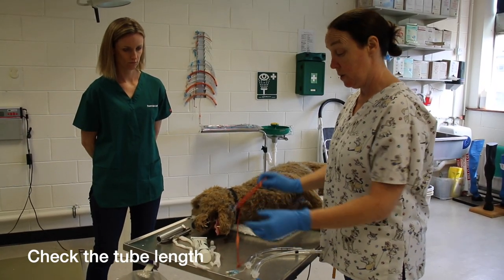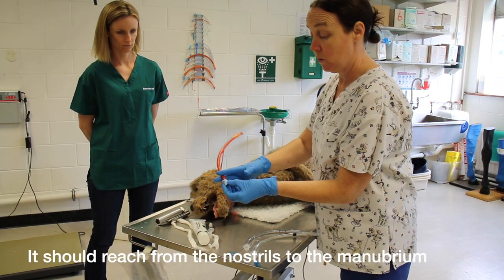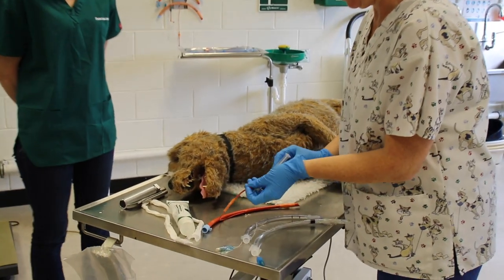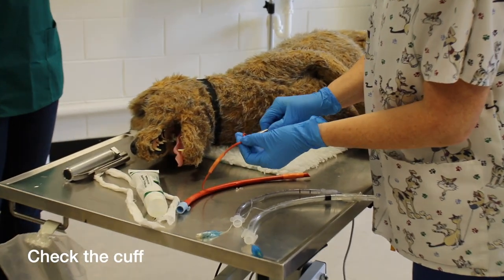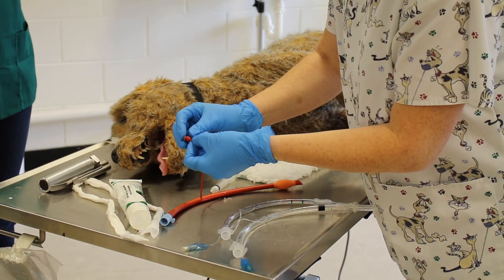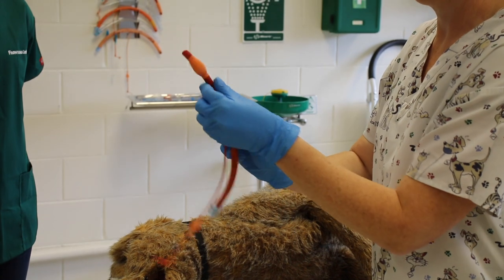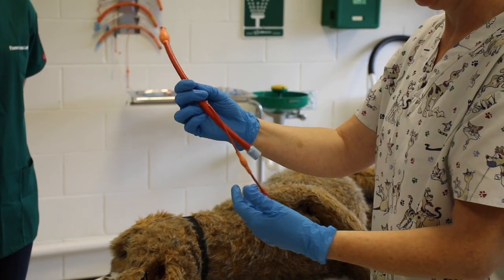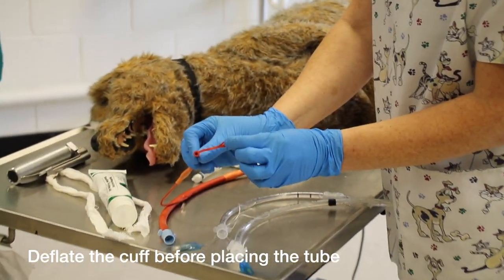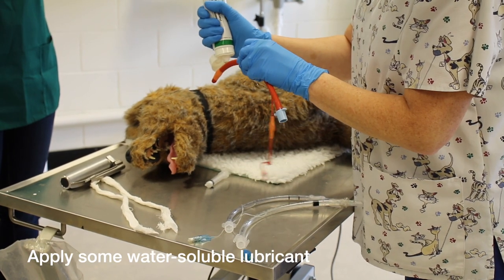We're going to check our tube — checking the length from the nostrils to the manubrium. If it's too long we'd cut it on this side and reattach our connector. We're going to check the patency of the cuff: inflate the cuff, make sure you close it properly so it stays inflated, check that it's inflated all the way around, and leave it for a minute. Then deflate by releasing your connector. Now lubricate the tube — just a small bit of lube.